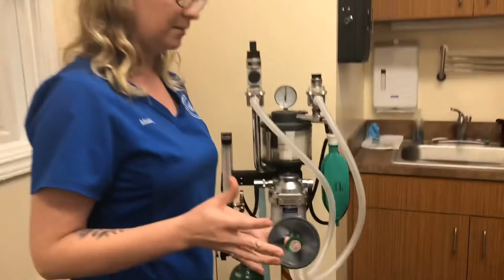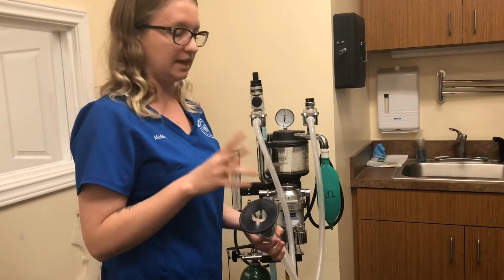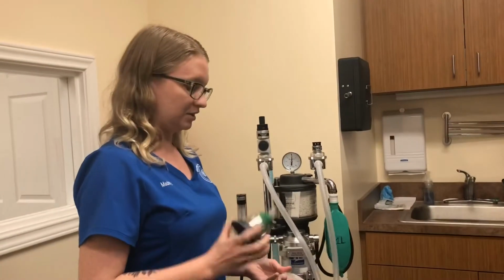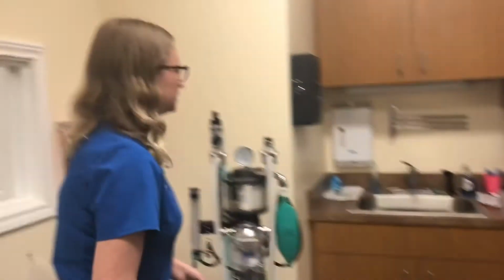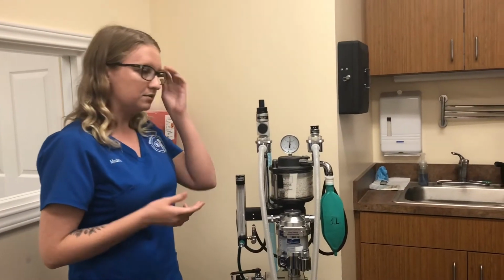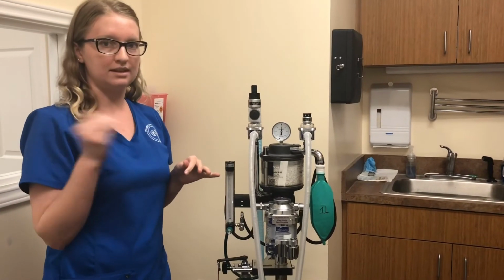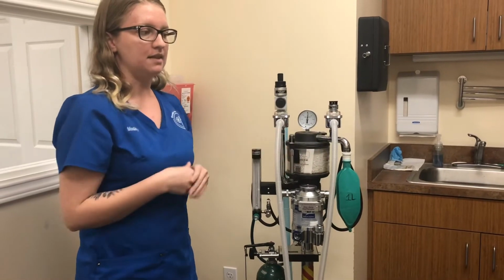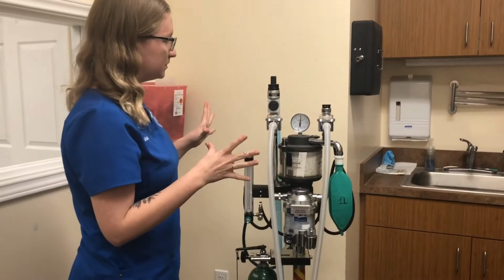Perhaps for a feline patient, or a patient that you don't need to intubate, you're just gassing them down for a short period of time, then you would use the mask, and there are different sizes too. There are also induction chambers. We don't have one in our clinic, but it's basically a sealed box that you pump the anesthetic into instead of intubating them or using a mask, and then they fall asleep that way. But this is basically the machine as a whole.